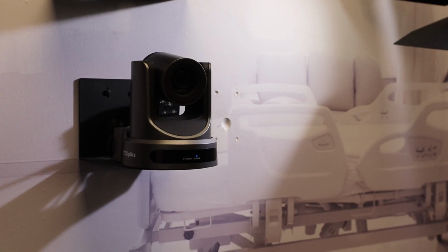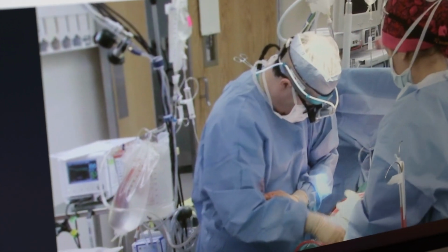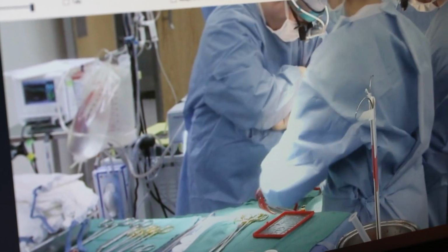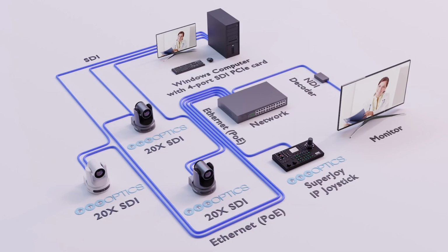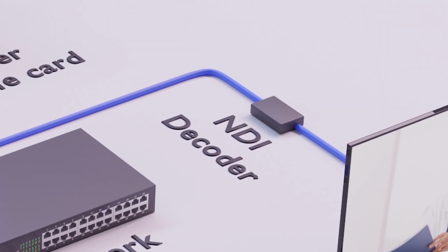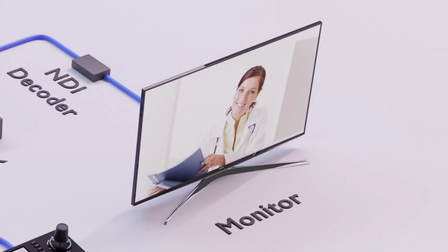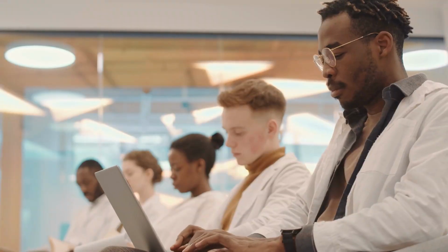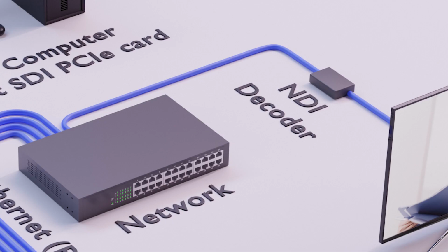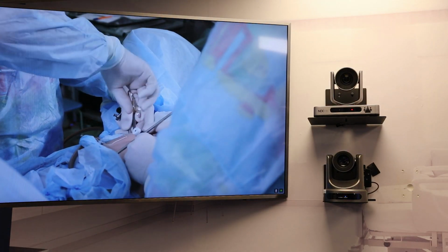Each PTZ camera can be used to zoom in to specific areas of interest to show detailed video during your surgical recordings. Because this system is used for educational purposes, an NDI decoder is used to take the output from vMix over the network and display it via HDMI on a monitor in the classroom. Additional NDI decoders can be added to the system on your network to display video anywhere you would like.